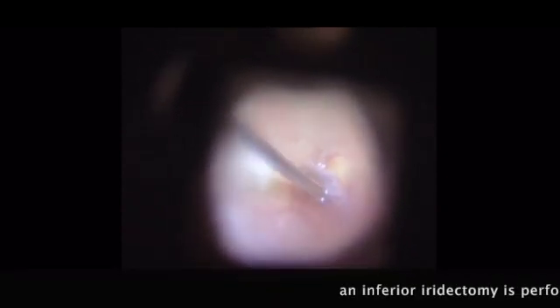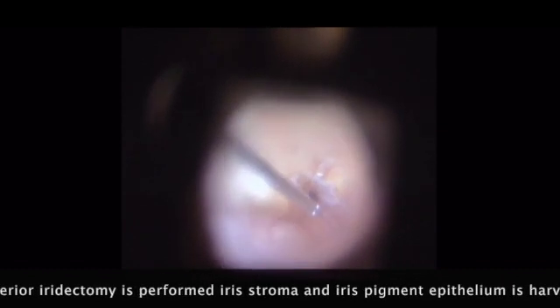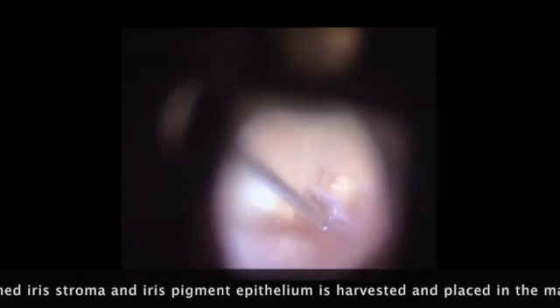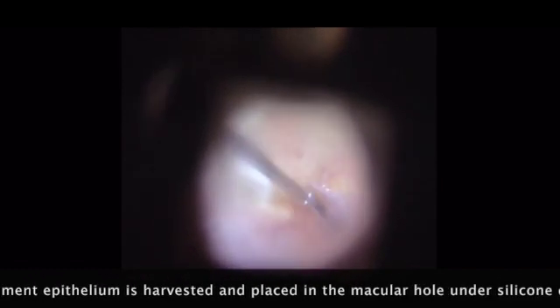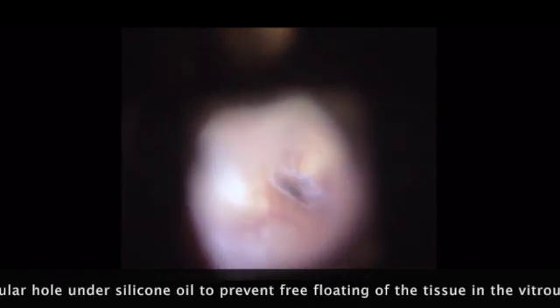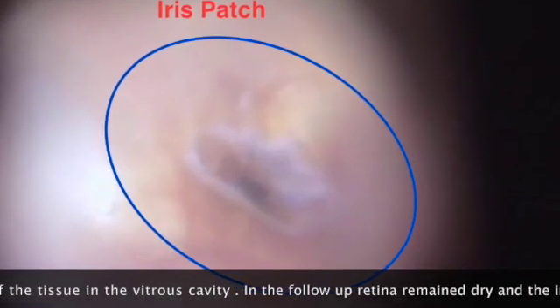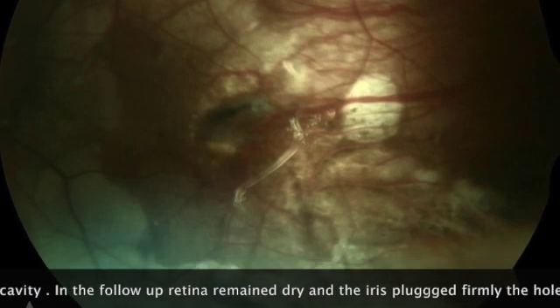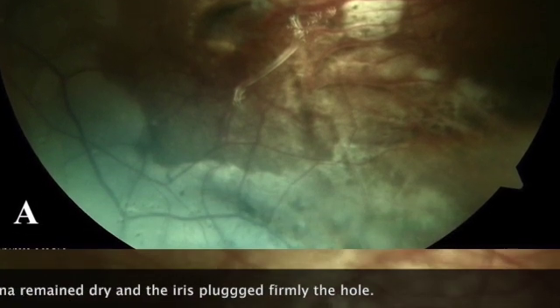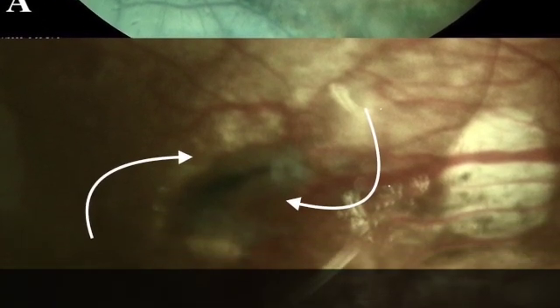An inferior iridectomy is performed, iris stroma and iris pigment epithelium is harvested and placed in the macular hole under silicone oil to prevent free floating of the tissue in the vitreous cavity. In the follow-up, the retina remained dry and the iris plugged firmly the hole.